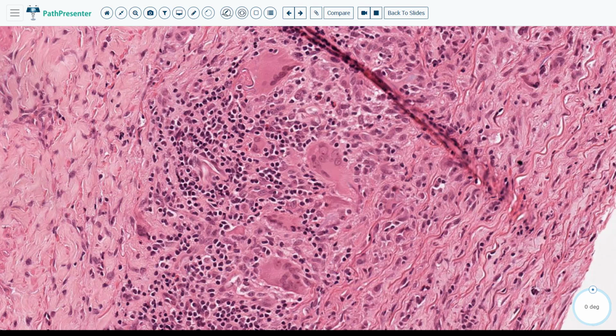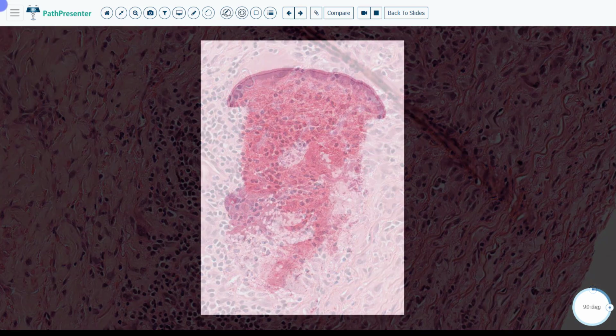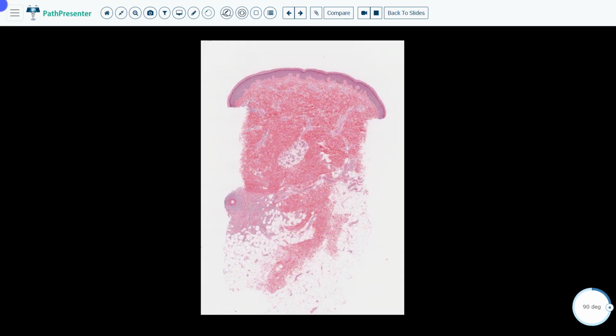Case 2 is, of course, Takayasu arteritis. Please note the histology of Takayasu arteritis is similar to giant cell temporal arteritis. They simply affect different blood vessels. Let's go on to our next case. Case 3 is Polyarteritis Nodosa. This particular patient scenario is in the setting of chronic hepatitis B.